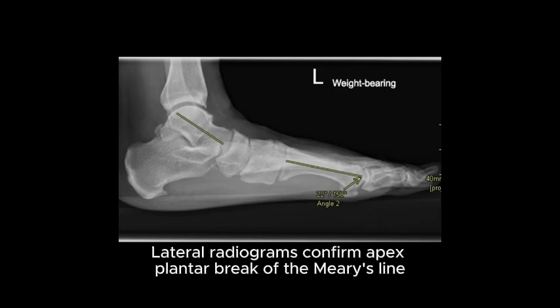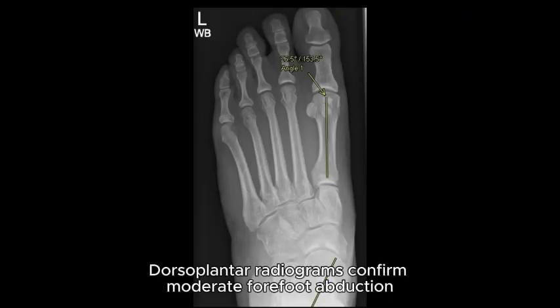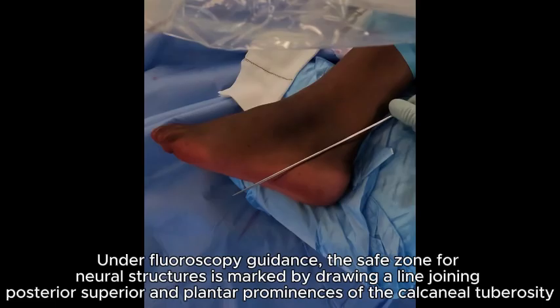up to 40 degrees. Lateral radiograms confirm apex plantar break of the Meary's line. Dorsoplantar radiograms confirm moderate forefoot abduction. Commence with minimally invasive medializing calcaneal osteotomy with patient in lazy lateral position. Operated leg up under fluoroscopy guidance.